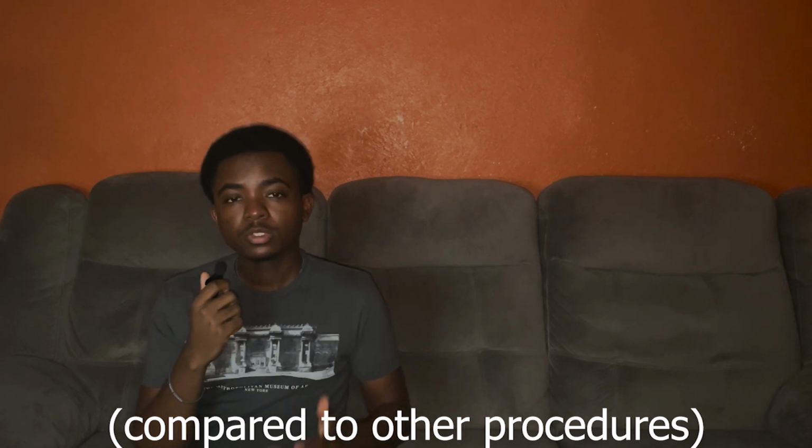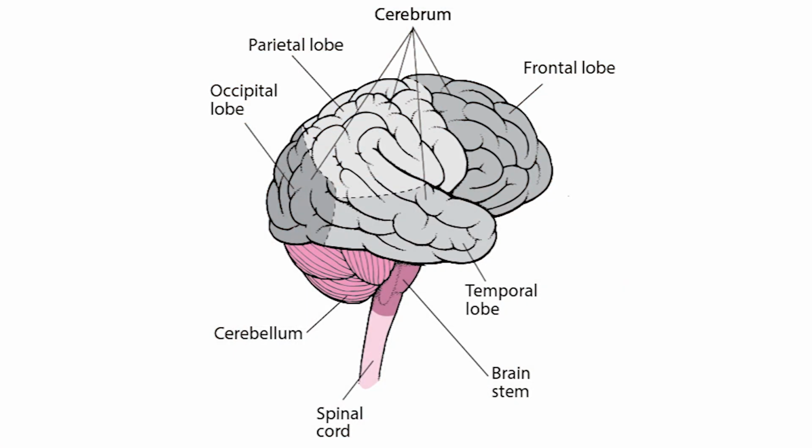The Focused Ultrasound for Parkinson's is also a fairly novel procedure, with it only being FDA approved for implementation in 2016. And so the sample size is quite small. Due to how new the procedure is as well, there are also some limiting factors, such as the fact that it can only be done to one side of the body, as the FDA has not yet approved its use for both sides, as damage may occur to areas of the brain that are responsible for speech.